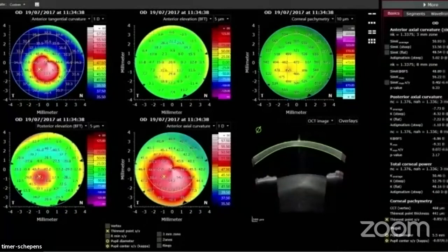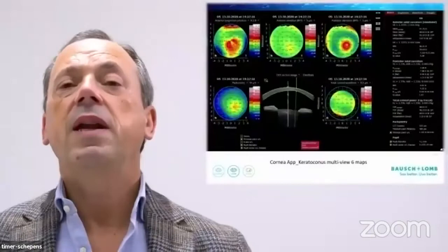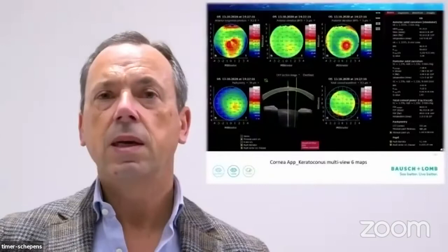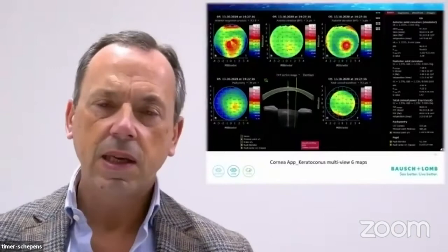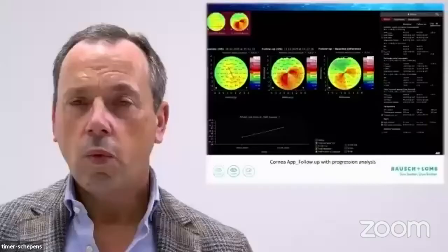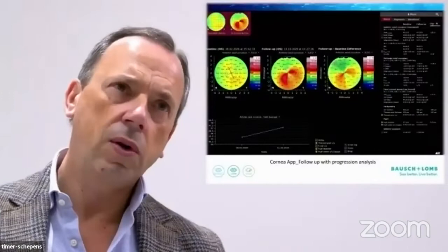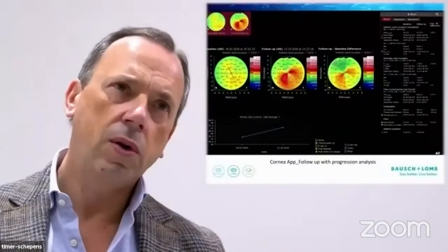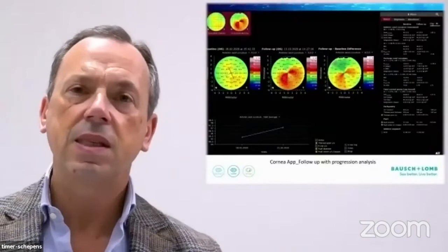Here we have another option for a multi-view in keratoconus, and these maps are very, very important to have the best surgical strategy for each patient. When I have to decide if I will perform corneal rings or not, the ACE is my main stable for having the best decisions in my daily practice. Here we have the progression analysis. When I have a new patient with keratoconus, I have the ability to have a period of two to three months, and I can use this app with progression analysis to have the best decisions at the best time.